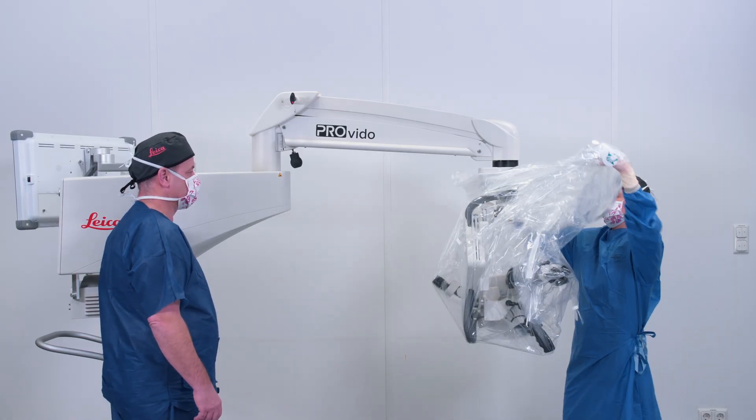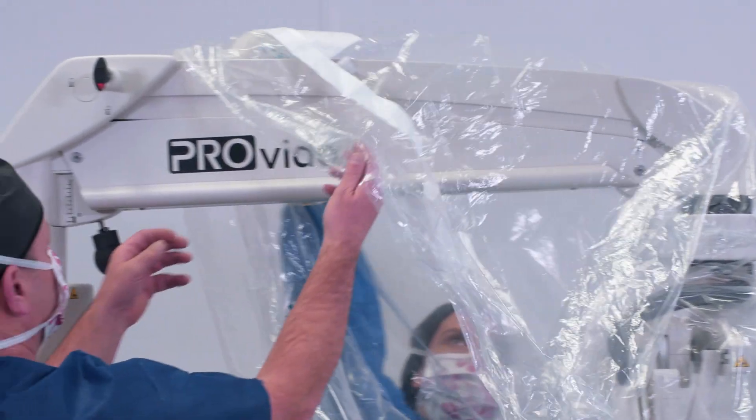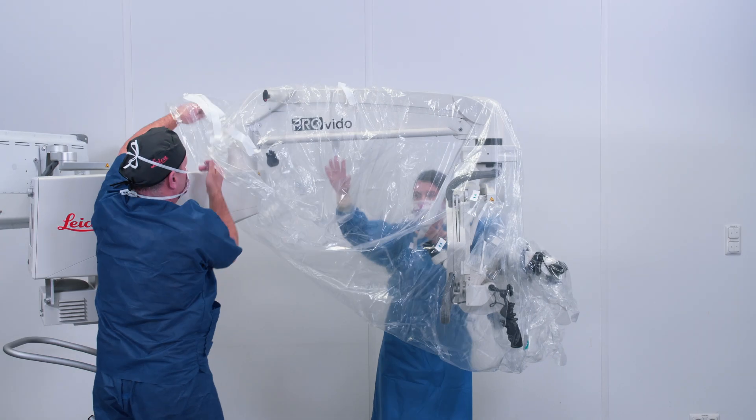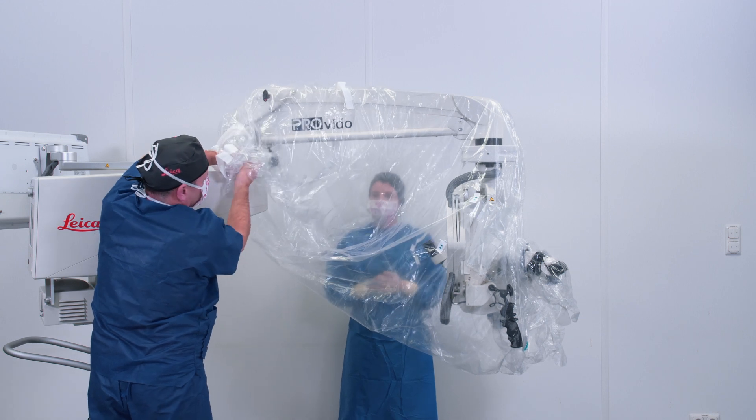Move the drape over the microscope head and pull it over the rest of the arm. Your circulator can assist you, pulling the drape from inside over the microscope arm and wrapping the last band.